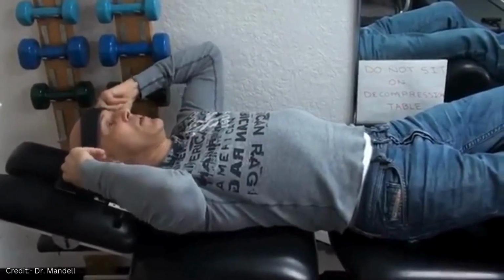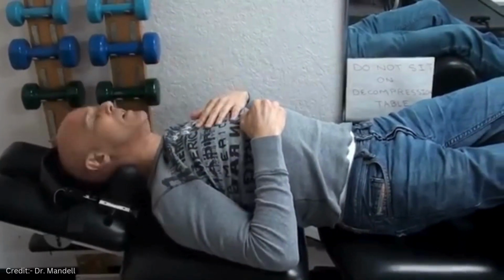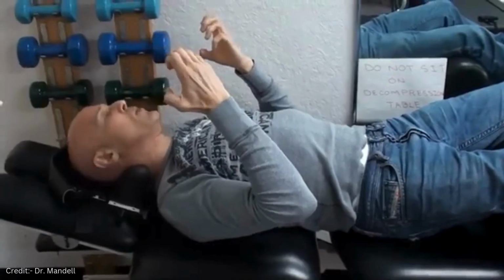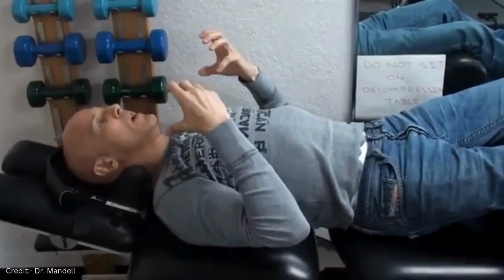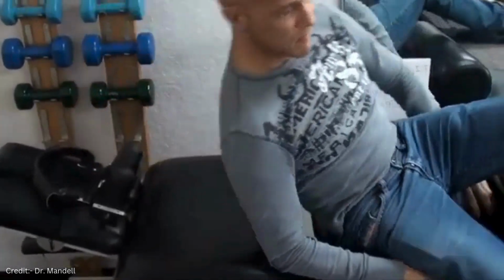After we complete it, we take the strap off, and then we want to move our head side to side for about 30 seconds to get the muscles to relax again, to make sure they don't splint and spasm. Then when you get up, you're going to come up, sit up on the side of the table. Do not ever come off any kind of traction right away, because you want to let the blood circulate away from the brain and to the brain so you don't get too dizzy when you get up. Then when you come up, again, you use your arms and you lift up like this.